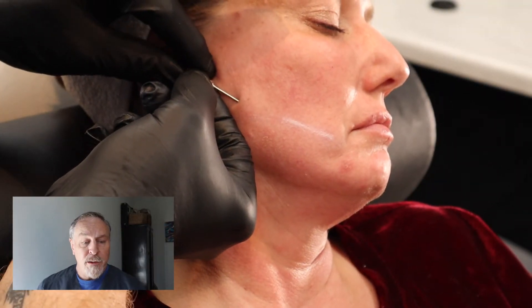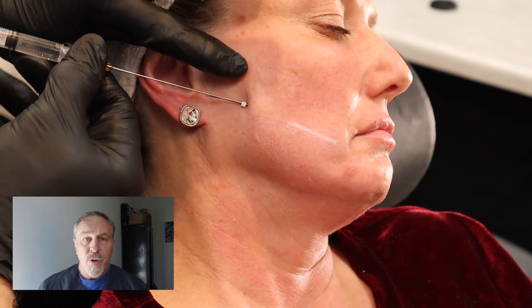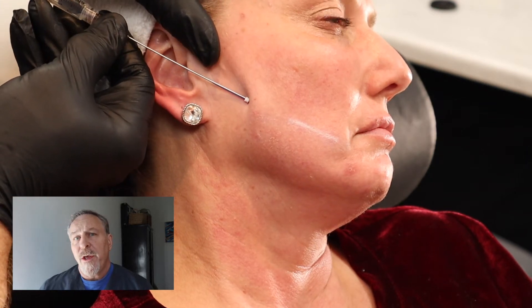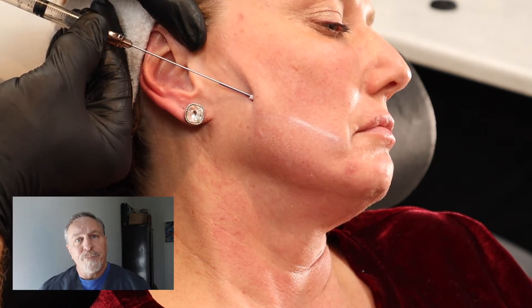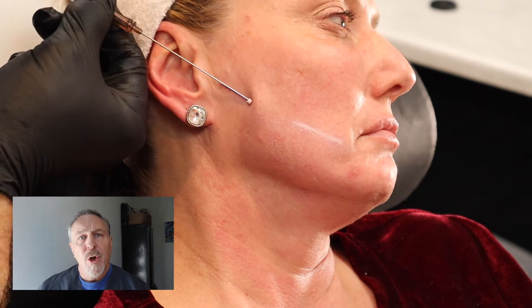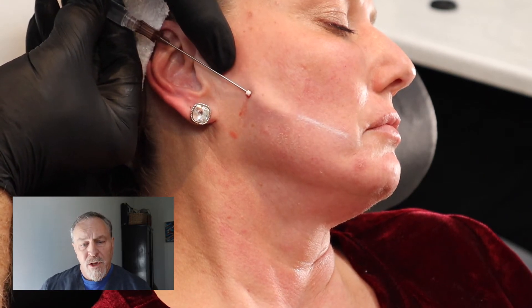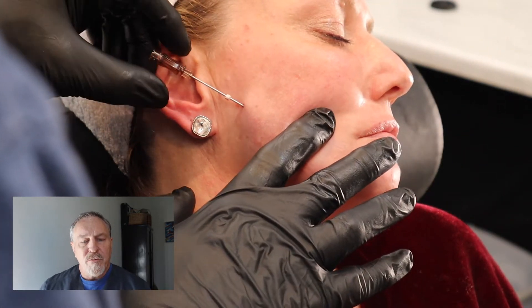The incision point is made just above the angle of the mandible with an 18-gauge needle. Then using sterile technique, the introducer is placed through the skin and tracked in the subdermis. If you get too close to the superficial part of the epidermis, you're going to be able to see the thread and it's going to move unnaturally. You want it deep enough so that it's very discreet and more comfortable for the patient long-term. There may be some discomfort for about two days and up to two weeks, but eventually the natural healing response will set things in place. You track the cannula under the skin, then take it back out leaving the thread behind, and you can feel the barbs as they engage.